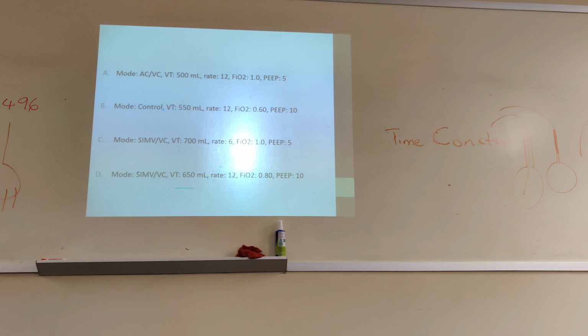Mode, ACVC, tidal volume 500. It looks like it will be in that range, right? Respiratory rate of 12, FiO2 100%, PEEP 5. Yeah, that looks okay.